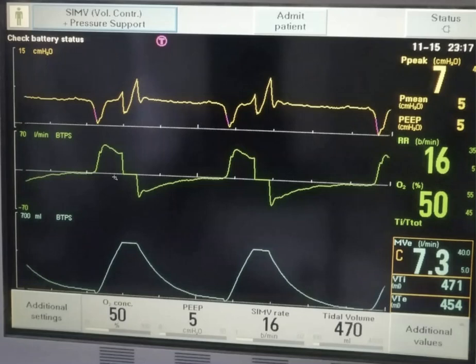Good evening everyone. There was some discussion about a screenshot on the WhatsApp group, so I thought I would go into a detailed analysis of these waveforms.